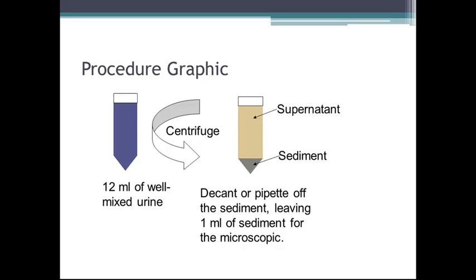Urine Microscopics Review Part 1 lecture. So we are going to review all of the microscopic urine parts up to this point.